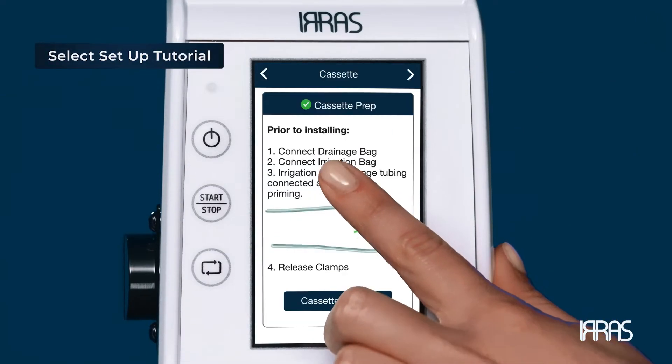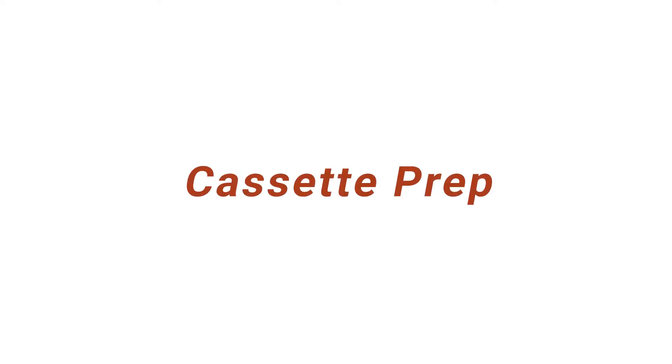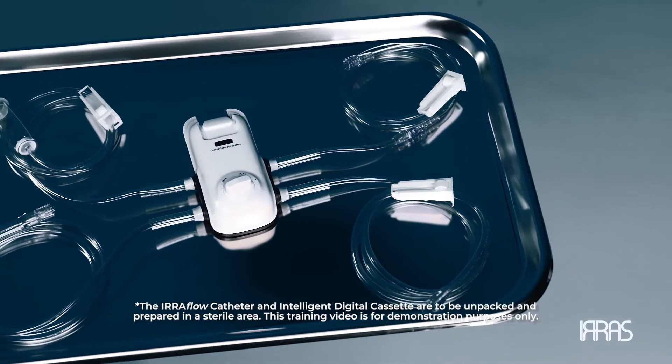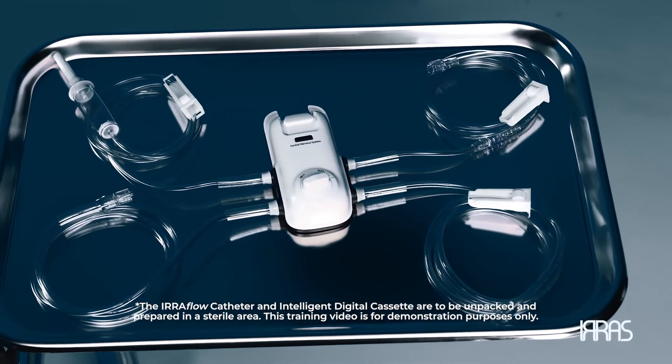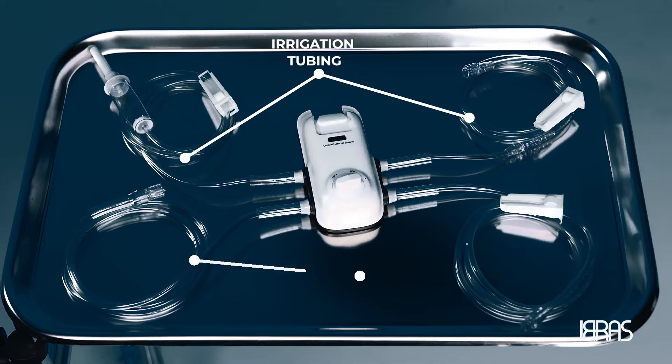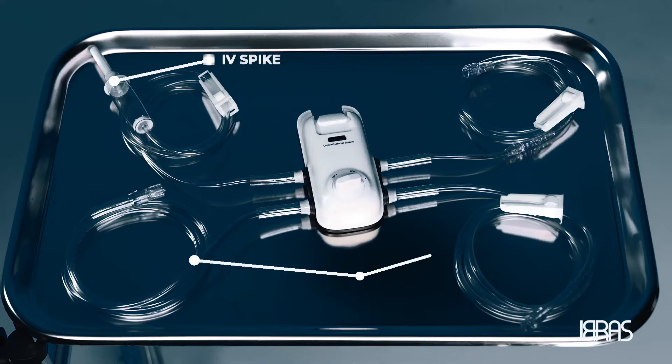Select Setup Tutorial. Cassette Prep. Open and prepare the intelligent digital cassette and drainage collection bag in a sterile manner. The intelligent digital cassette includes irrigation tubing, drainage tubing, and IV spike.